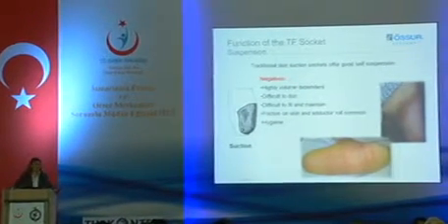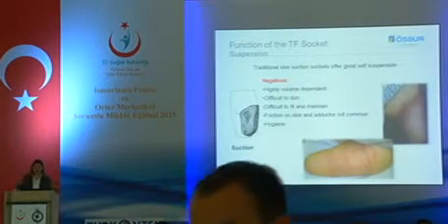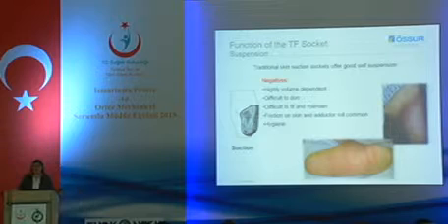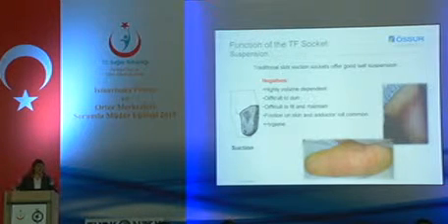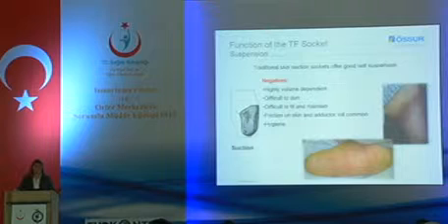It can be difficult to fit and maintain, so I'm sure we've all had to do quite a few check sockets to make sure that our volume is good within the socket. But if they change slightly their structure, then it's very difficult to fill up those spaces.